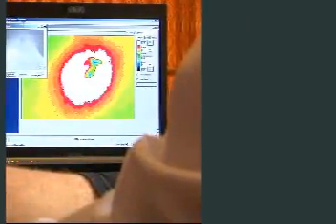So basically we just covered it up here. And because it's a little bit more salve than we expect, we'll put a piece of paper over it.